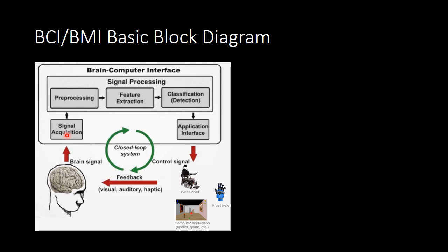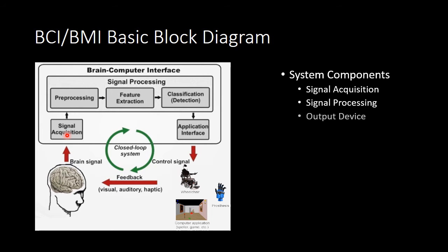Let's look at the basic block diagram of a BCI or BMI. Like any communication or control system, a BCI has an input, that is electrophysiological activity from the user, an output, that is the device commands, the components that translate the input into the output, and a protocol that determines the onset, offset, and timing of operation. The figure shows these elements and their particular interactions.